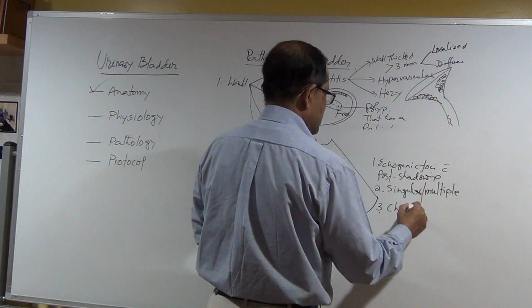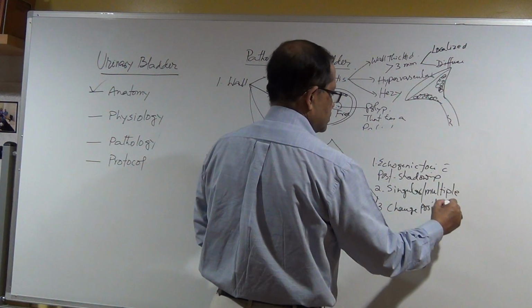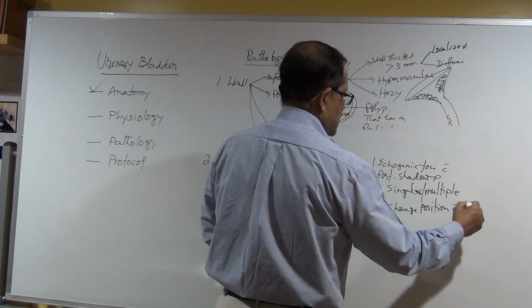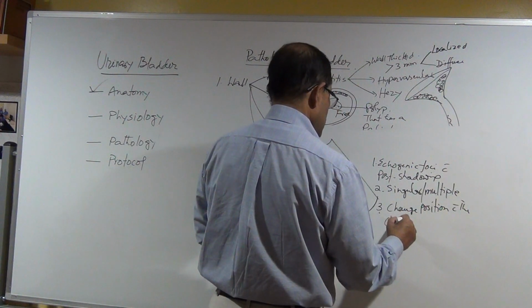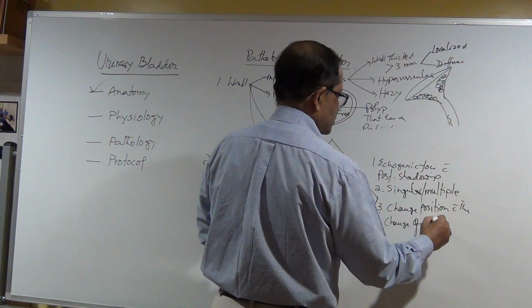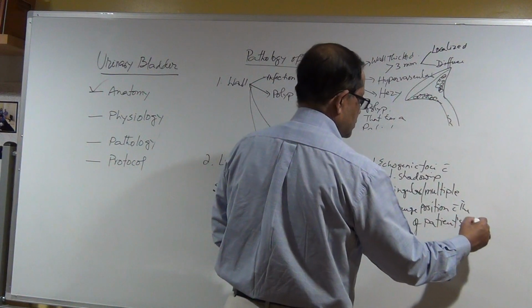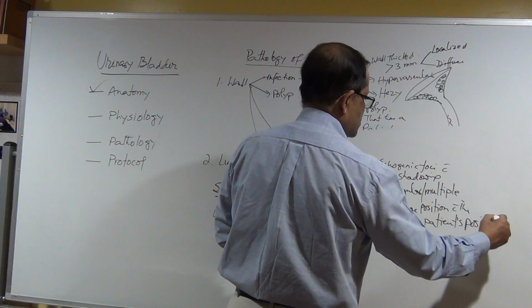It changes position with the change of the patient's position.